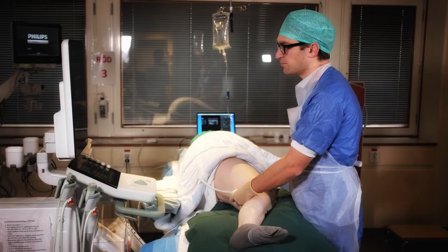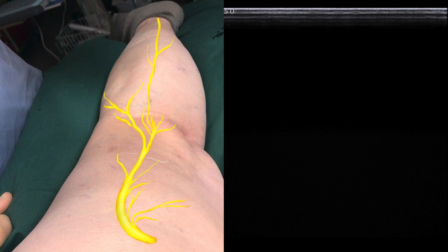The block can be performed in prone, supine, or as pictured here in the lateral position. In this picture of the patient's right leg, we've superimposed the sciatic nerve. Just proximal to the knee, there is a bifurcation where it splits into a lateral peroneal and a medial tibial branch. This is where we will place the block.